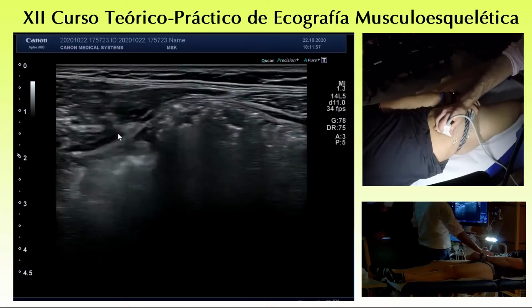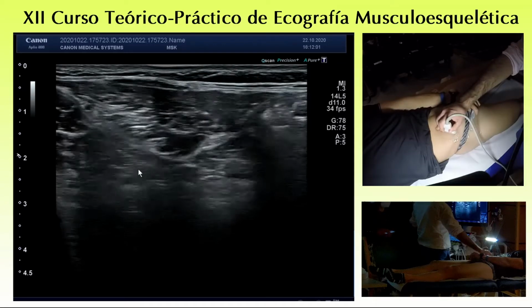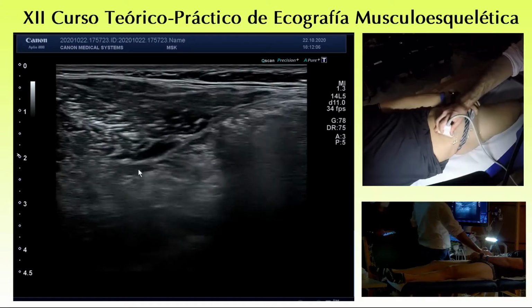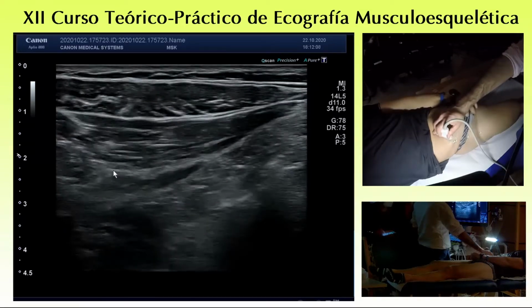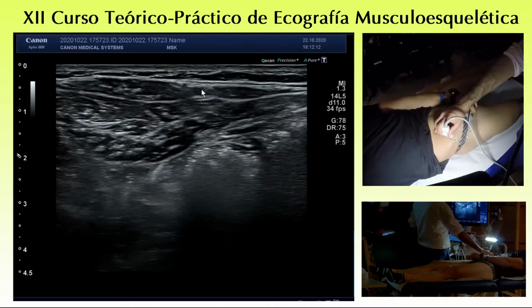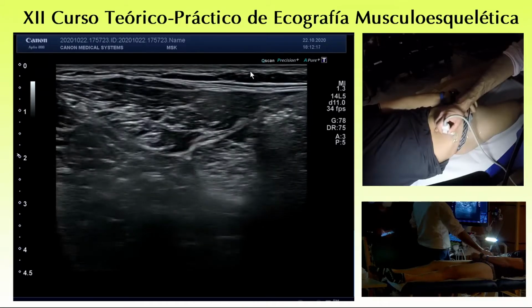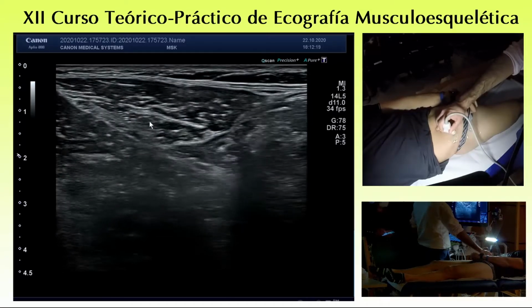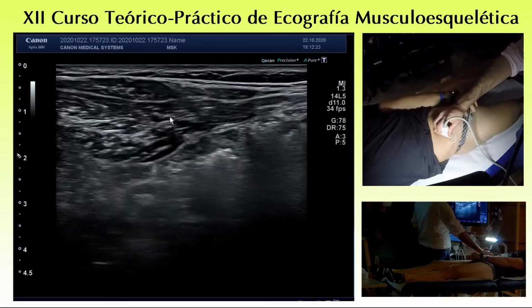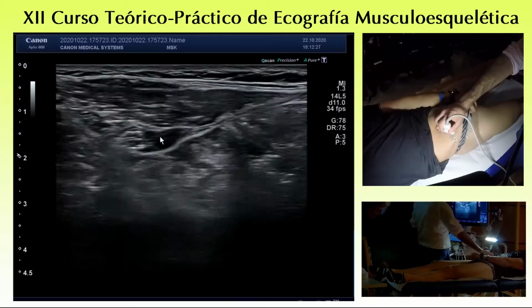Okay, because basically this is the common point. Then from this point, the iliohypogastric goes immediately superficial to innervate the anterior muscle wall, because there are also motor branches. It innervates the anterior muscle wall and then the skin. And the ilioinguinal goes into the canal. So look at this point and look for any alteration along the course, along the path.